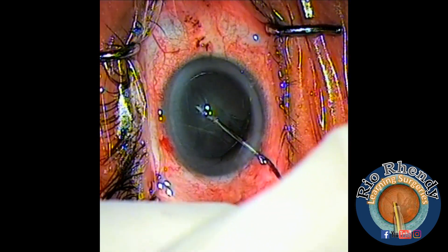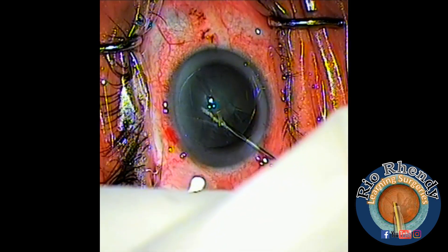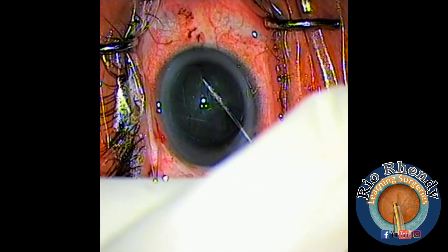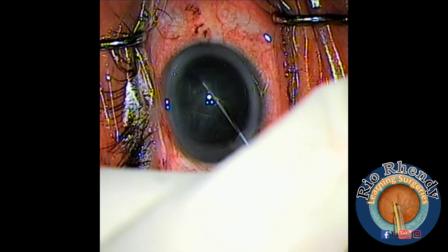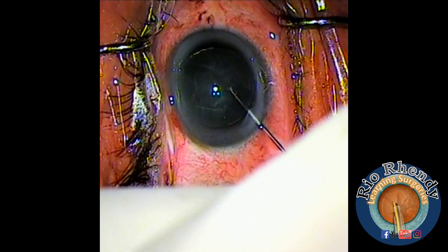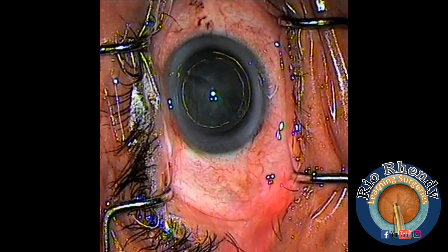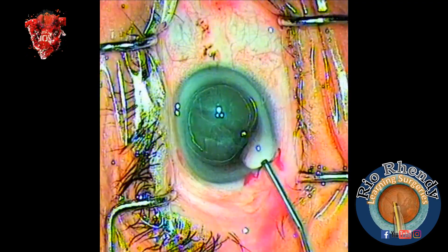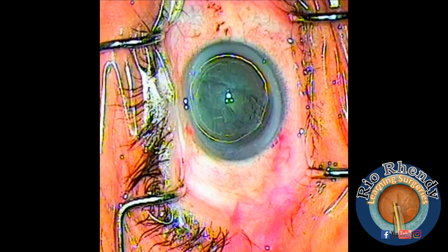You can see the fluid wave from one equator to the other equator. I also perform hydrodelineation. For soft cataract, I use hydrodelineation because it's a little bit hard to impale the lens, so you need to use another technique. This is one technique I use to remove the soft cataract nucleus.